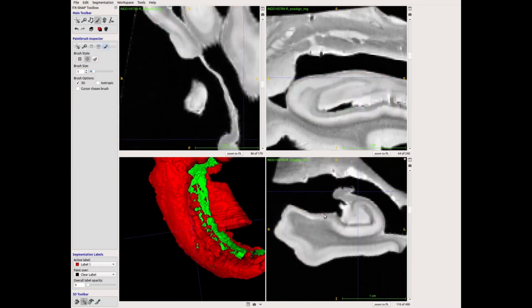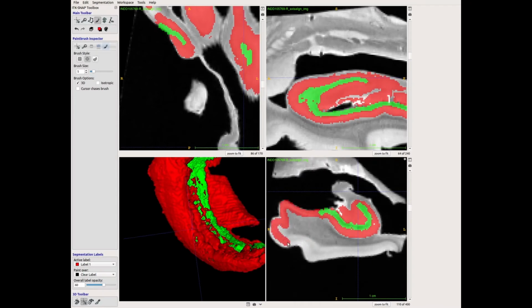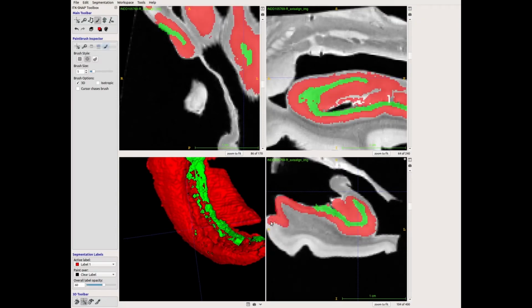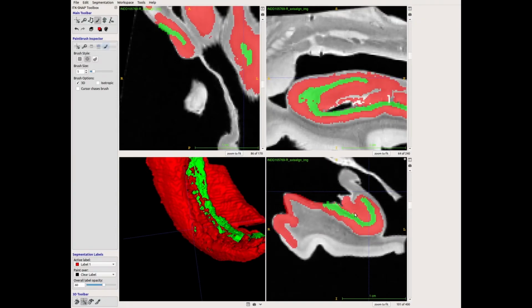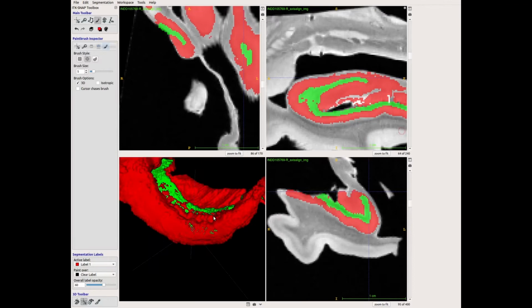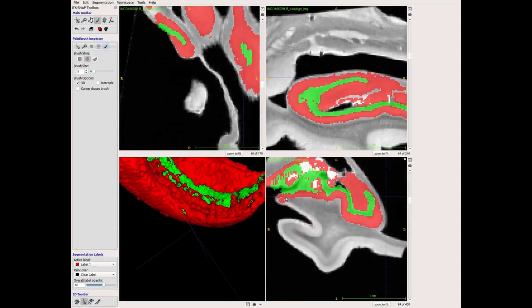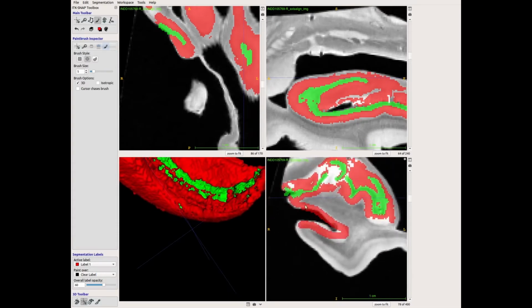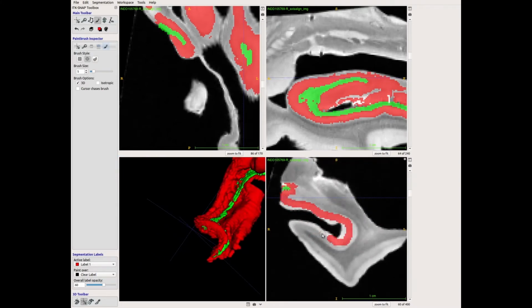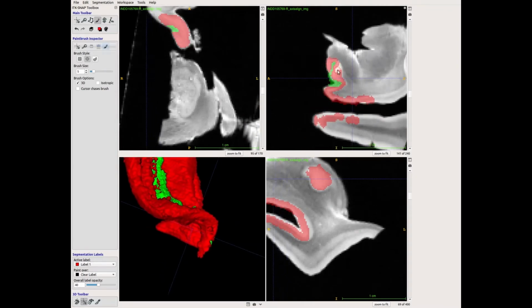And my rule of thumb here, at least for a first pass, is I'm really just going to overestimate how much gray matter is actually part of the hippocampus. And we'll see later on in the protocol, I will cut some of that off. But just to make things nice and simple for us, we're going to overestimate this, and then we'll use the erosion and dilation with some thresholding in order to get good tissue segmentation, and then we'll draw a boundary heuristically of what we consider to be medial temporal lobe cortex and what we consider to be just within the hippocampus still. So you can see this is clearly not part of the hippocampus. We're in a sulcus posterior to the hippocampus, but I'm just overestimating all the gray matter that might be part of the hippocampus.